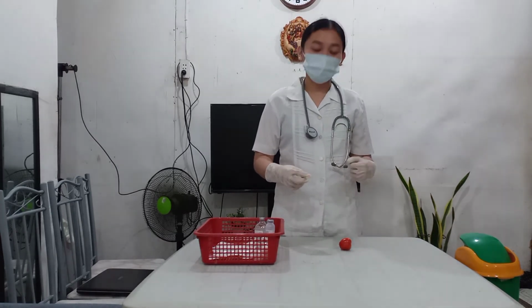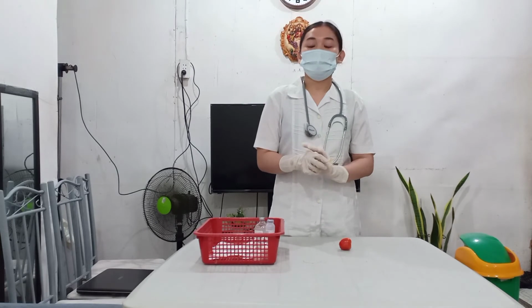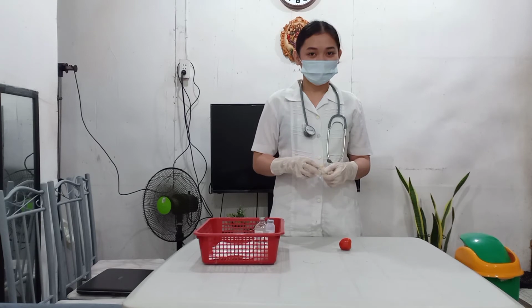And then, after which we have already completed the intradermal injection for skin test. And then we will just wait for the reaction of the patient to the drug that we injected into his or her skin.